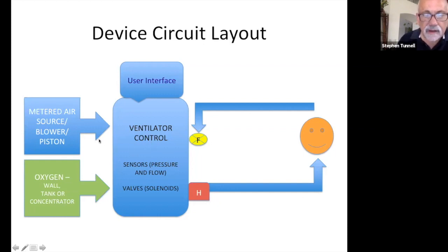So we plug our sources of gas into the ventilator, we turn it on, and the ventilator is going to deliver gas to the patient. It uses two methods. Either it's targeting a pressure level, a pressure above ambient air to drive oxygen in, or it is trying to reach a flow rate.